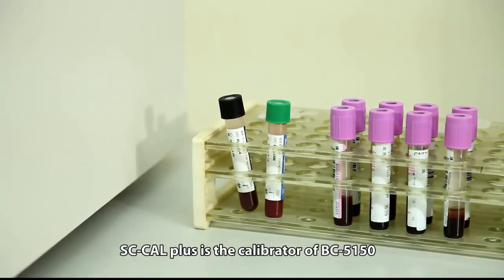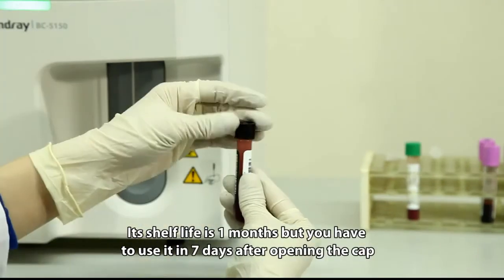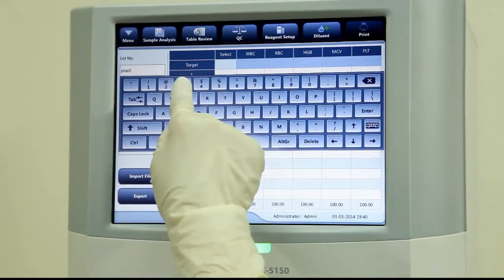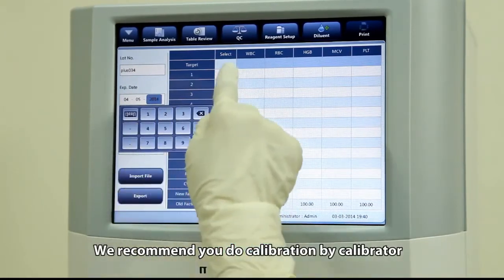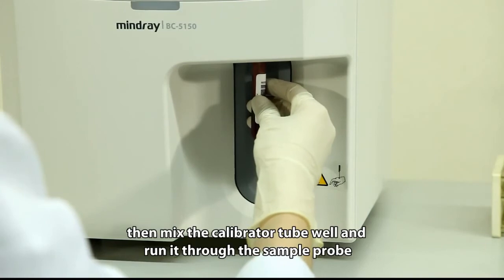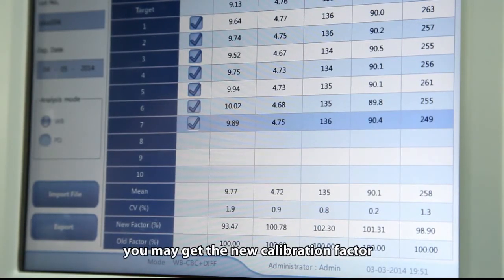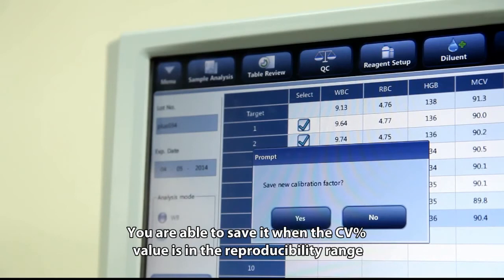SC CAL Plus is the calibrator for the BC5150. Its shelf life is one month, but it must be used within seven days after opening. It is recommended to calibrate using the calibrator. Input the target value of the calibrator first, then mix the calibrator tube well and run it through the sample probe. After running the calibrator six to ten times, you may obtain the new calibration factor. Save it when the CV percent value is within the reproducibility range.